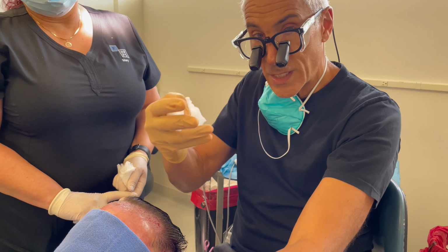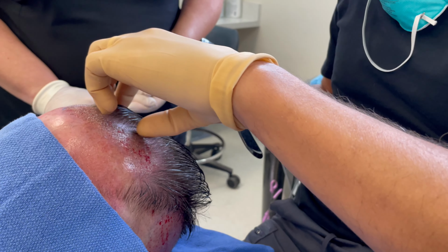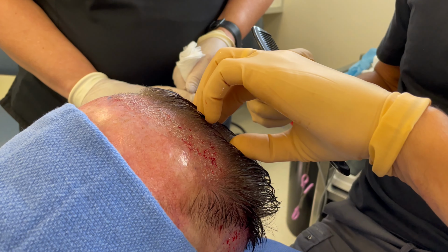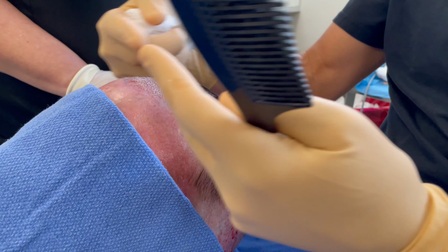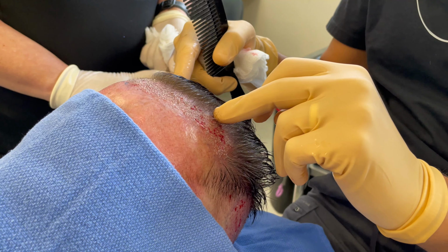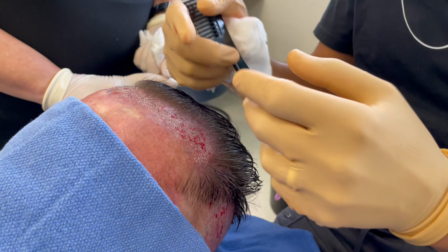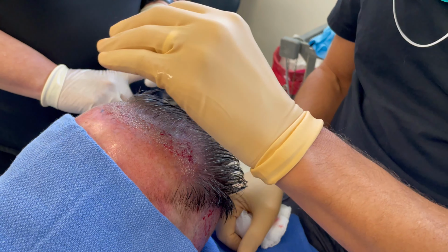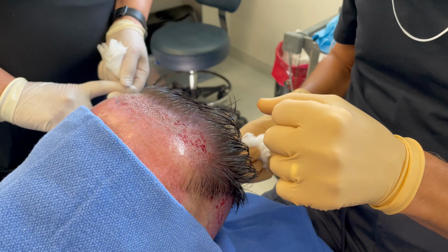This is a patient I did a prior transplant on. So he doesn't have the thickest donor hairs, but I was able to achieve a nice improvement. But he's coming back today. He underwent an endoscopic brow lift elsewhere, so we're filling in the scars, but he's seeking to have his hairline brought back down. So I've already planted, we're doing a little over 1,900 grafts on him to restore this frontal area.